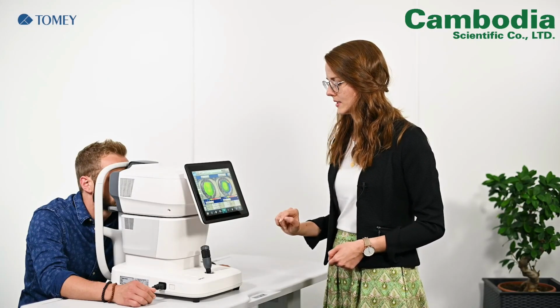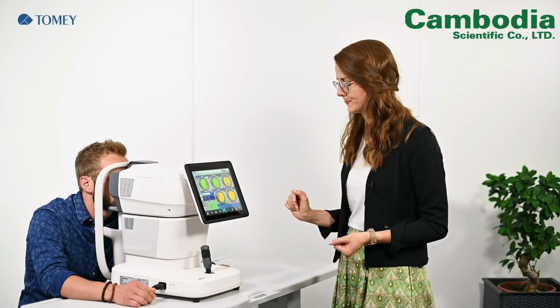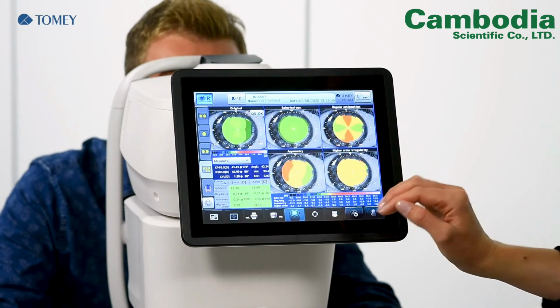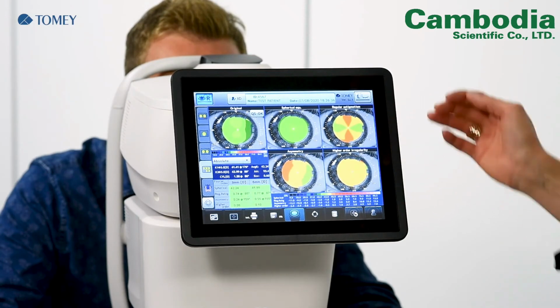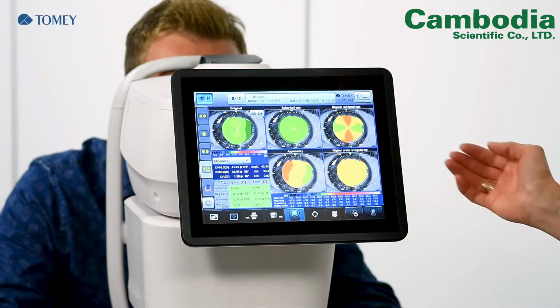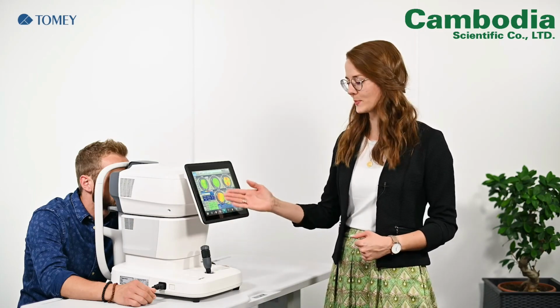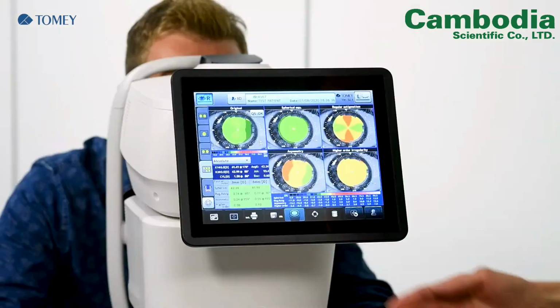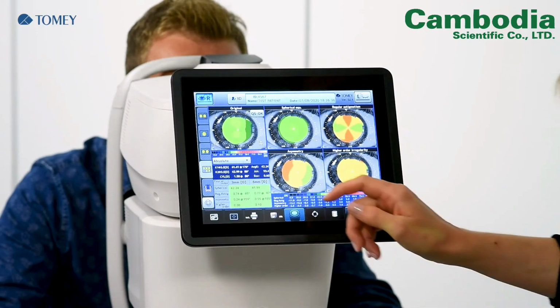And last but not least, we have the possibility to show a Fourier analysis. In the Fourier analysis, you can see the original map, the spherical equivalent, the regular astigmatism and asymmetry, and also higher order irregularities. Any abnormalities would be highlighted in the chart in yellow or red color. In this case, it is all green, so it is supposed to be everything fine.